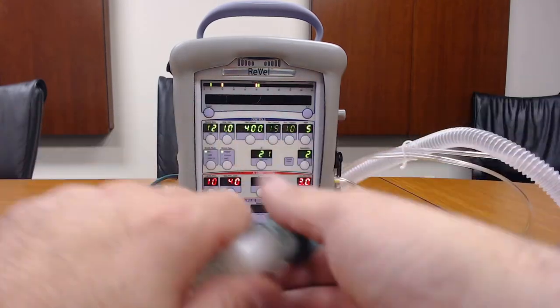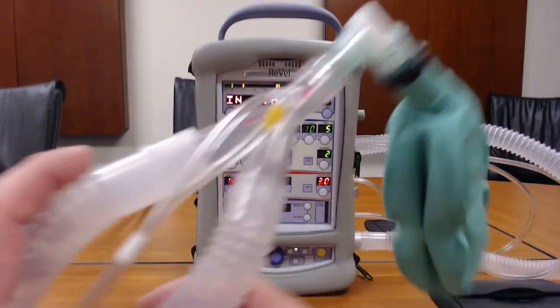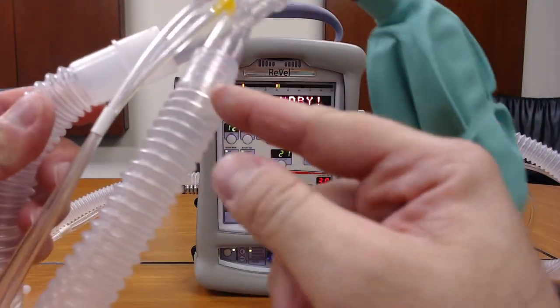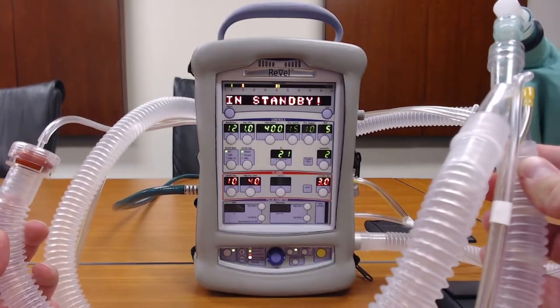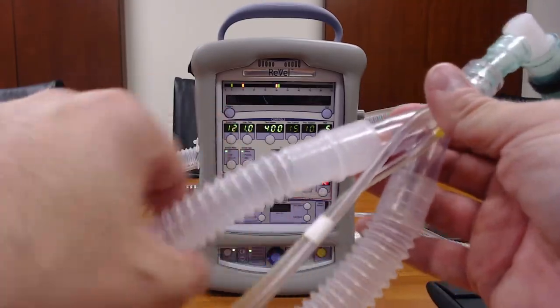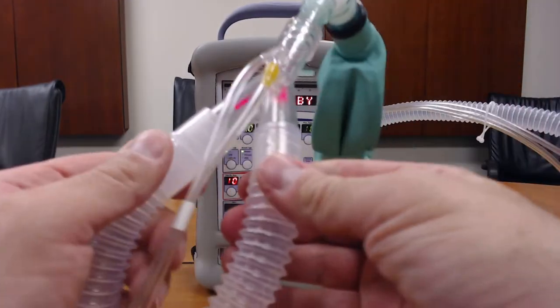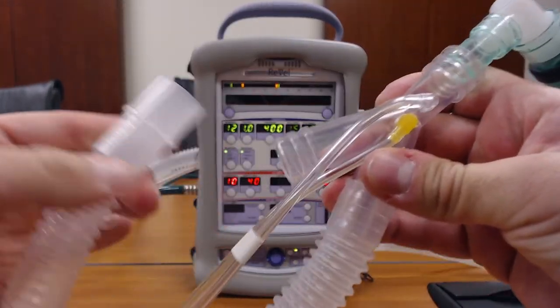Now, to use nebulized medication within the system, we have our vent circuit. There are two sides to the Y. This side is the exhalation side, which terminates in a relief disc on the end. The other side is the inhalation side, which connects directly to the vent itself. The exhalation side is crimped onto the Y and is not removable; however, the inhalation side you can twist and remove.